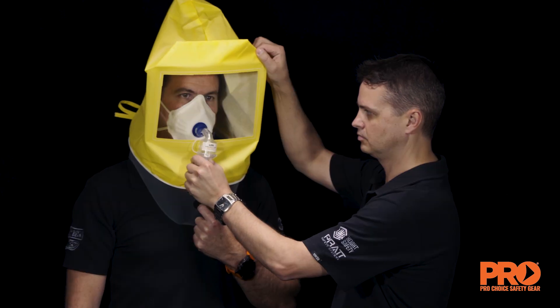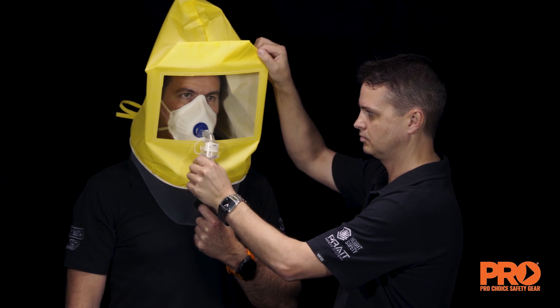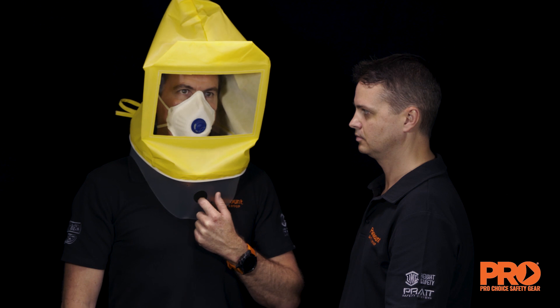The test is terminated at any time a bitter taste of aerosol is detected by the subject, as this indicates an inadequate fit. Wait 15 minutes and perform the fit test again. Repeat the fit test after redonning and readjusting the respirator.